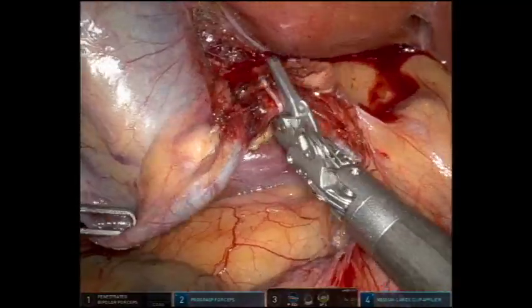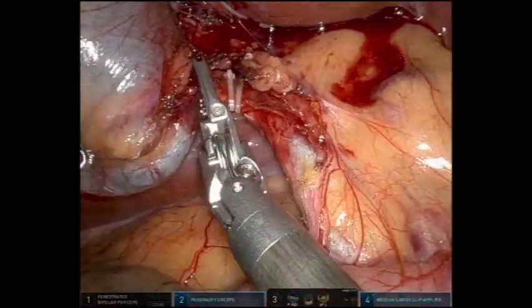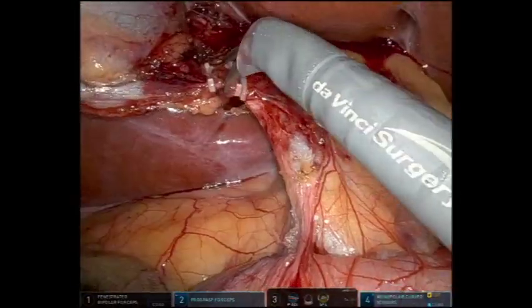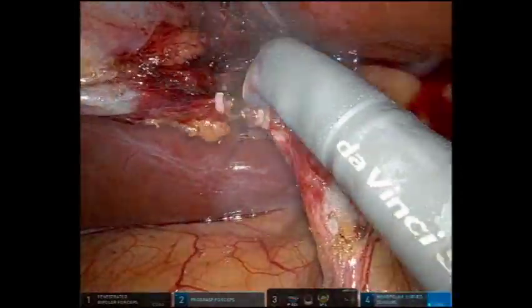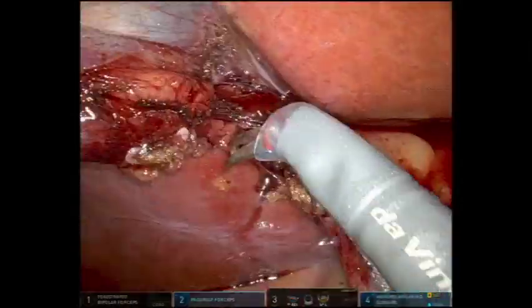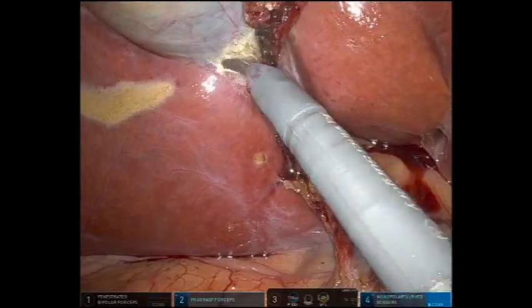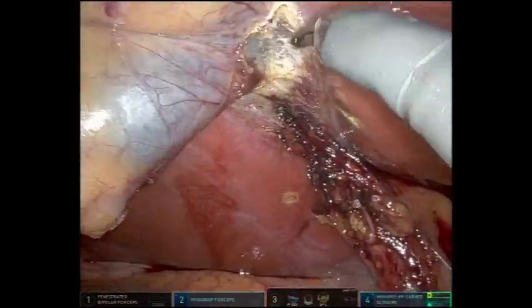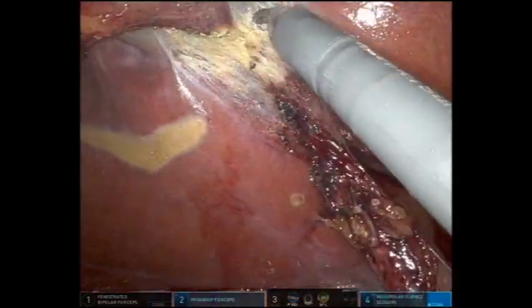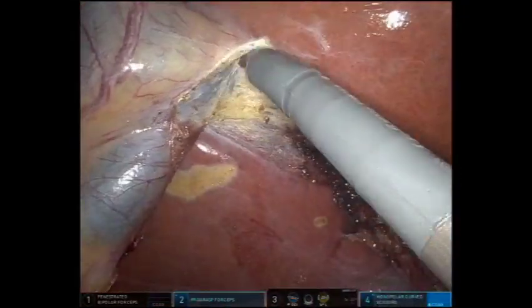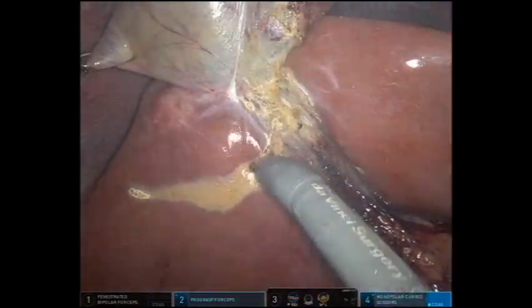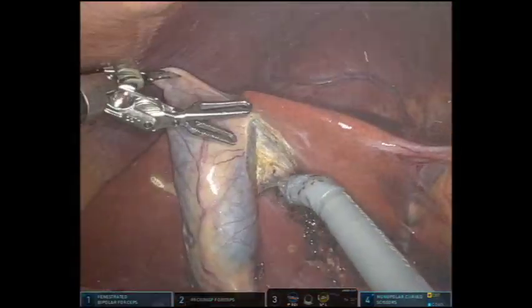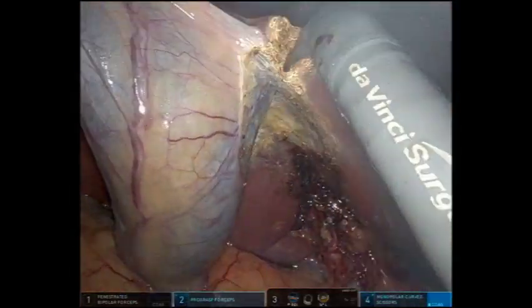Clips were then placed on the cystic duct and the duct was transected using the robotic scissor. The attachments between the gallbladder and the liver were taken down using the scissor, with traction used to maintain the dissection within the avascular plane.